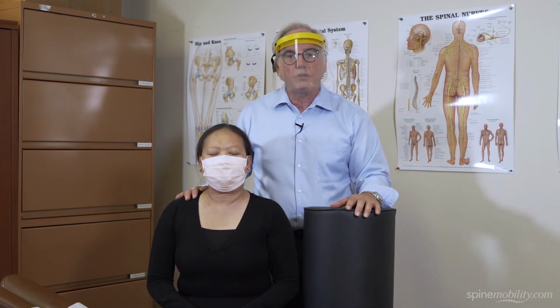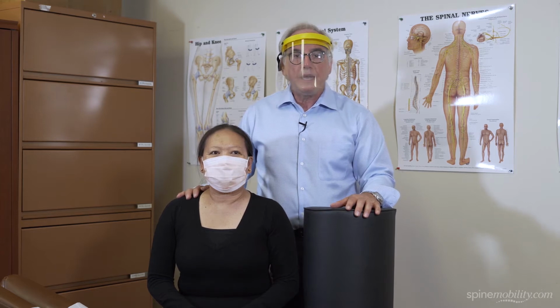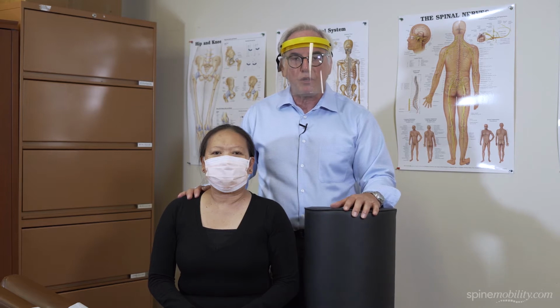This is Lilybeth. I'd like to thank her for volunteering to help us demonstrate the use of the Spinemobility Bolster. In general, there are 3 specific ways that the bolster can be used.